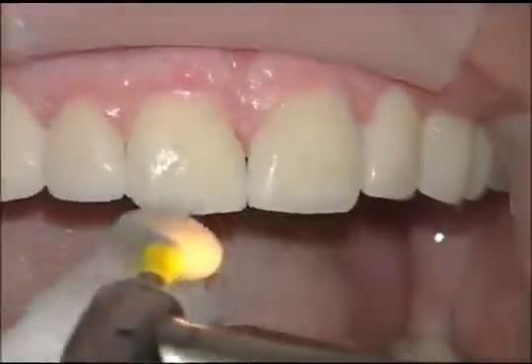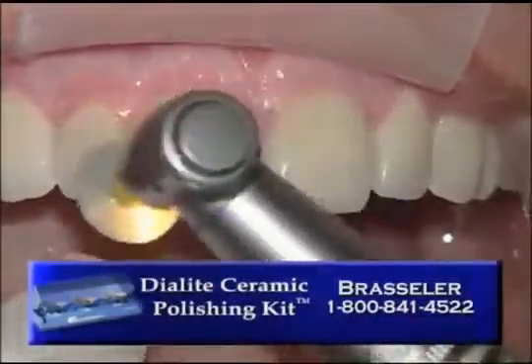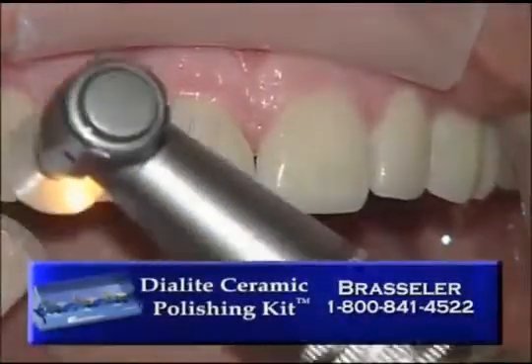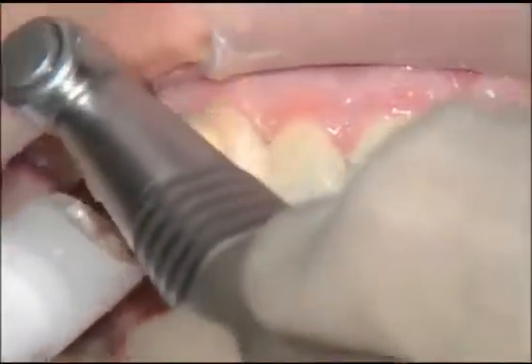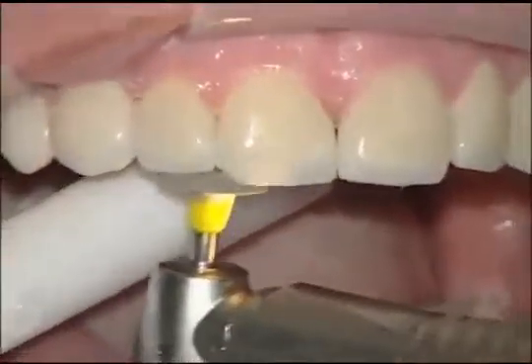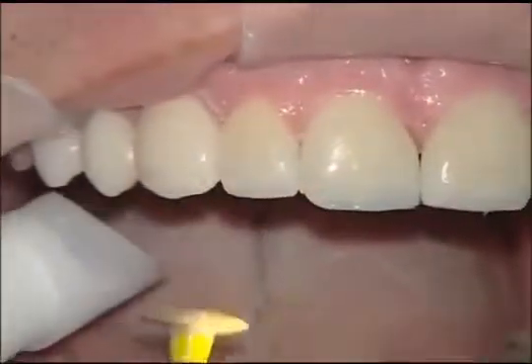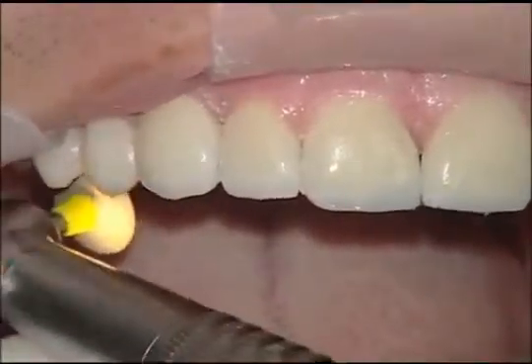This is the last stage of the Brasseler Dialite. We've gone through the two previous wheels, and now this is the gray high shine wheel, and we're going in at about 20,000 RPMs with a ton of torque, with the opportunity to really polish these up and really make them look nice. You really don't see the big difference till the very end when you actually use that gray wheel.